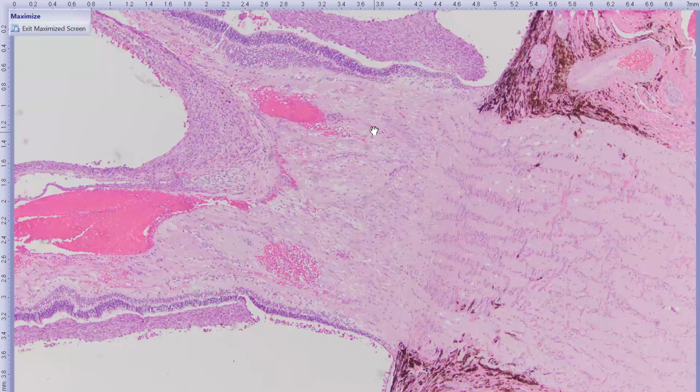So as I said earlier, this pattern of neoplastic cells carpeting surfaces in the eye is characteristic of a metastatic neoplasm, meaning that this neoplasm originated somewhere else in this dog's body and then arrived in the eye, probably via vasculature, blood vasculature. I did not find any neoplastic cells in any blood vessel lumens in this case, but presumably that is how they arrived in the eye.